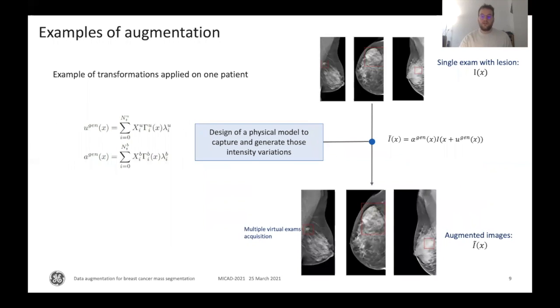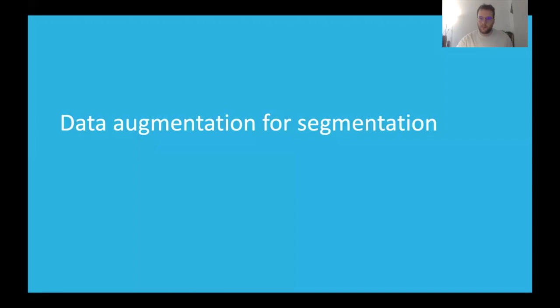So we can generate some augmented data from one patient acquisition. So here it's a fixed one patient image, and we can generate new data. Here you can see the pectoral muscle is sometimes larger, sometimes it's smaller, sometimes you can see the inframammary fold, sometimes not, as in real applications. Okay, so we have our augmented data sets. Now we can test it with segmentation.